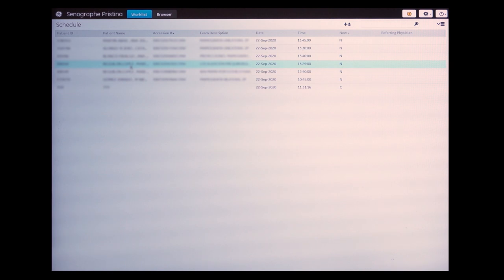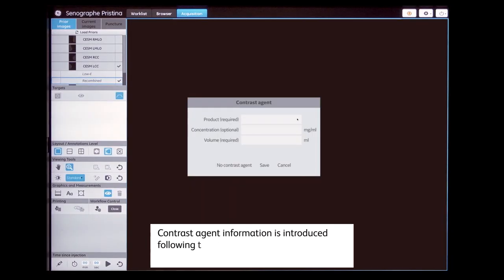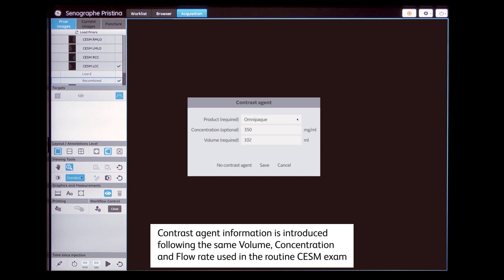The patient has already been informed about the exam, risks, benefits, and how much her cooperation is crucial to the success of it. The CESM biopsy exam is started from the acquisition workstation.